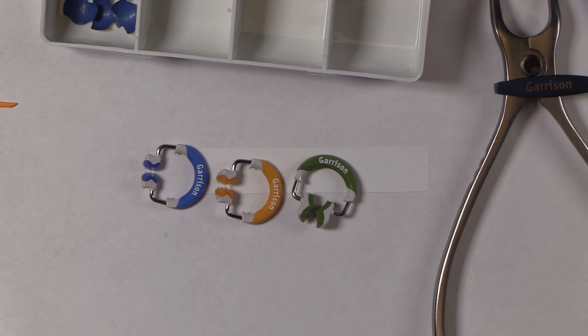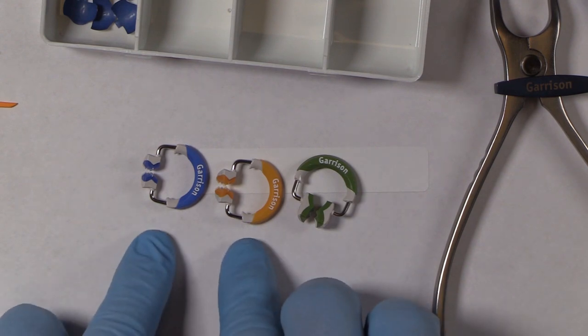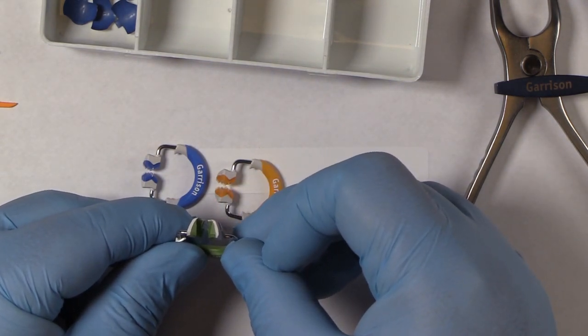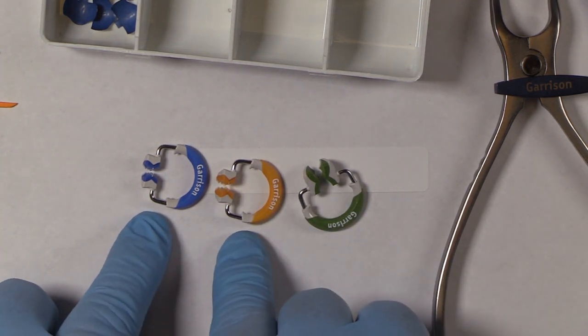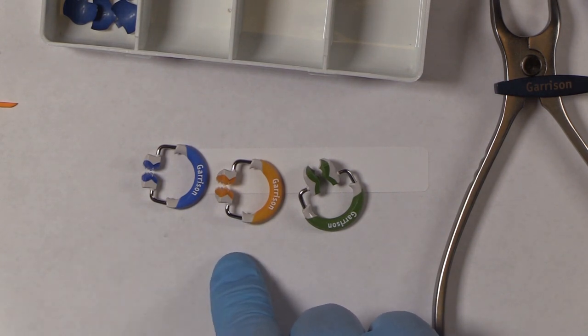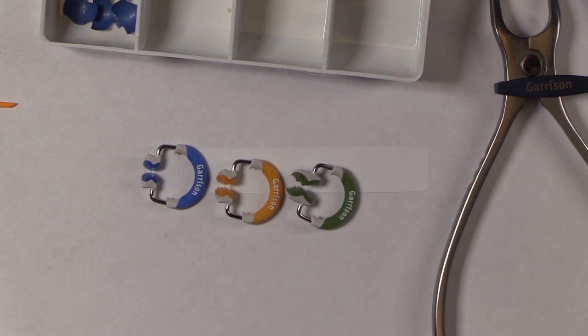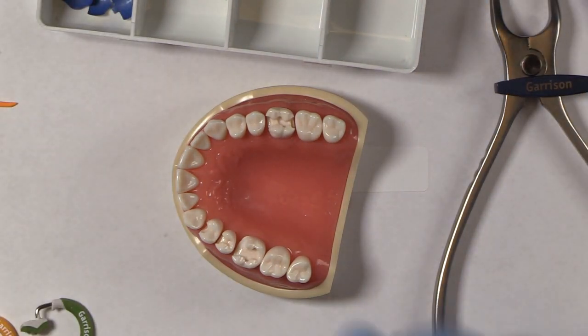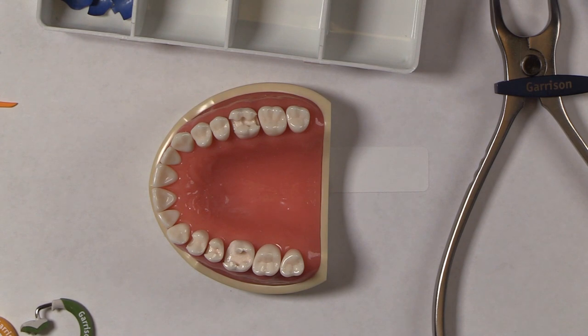To summarize the changes: the horseshoe shape provides additional mechanical advantage; all rings including the wide prep ring now have retention extensions; the blue and orange are now identical in gripping power with height differences maintaining stackability. Many of these ideas came directly from annual customer surveys. When you're a Garrison customer and receive one of those surveys, it's really important to fill it out — tens of thousands of minds can come up with great ideas, and we've been able to incorporate them.